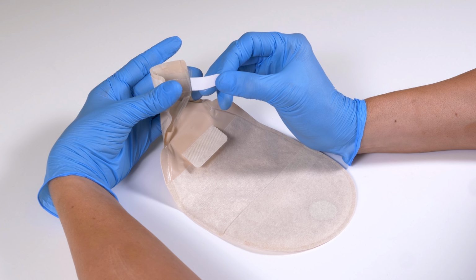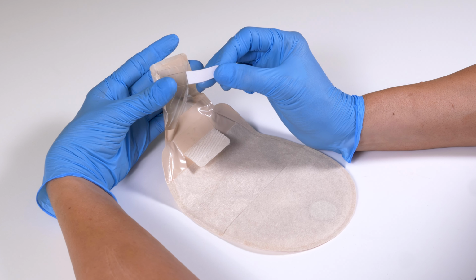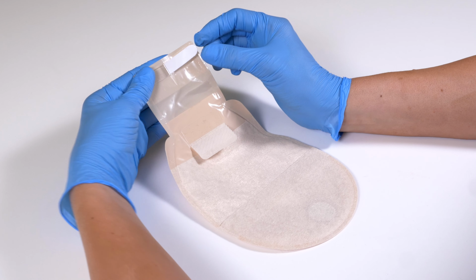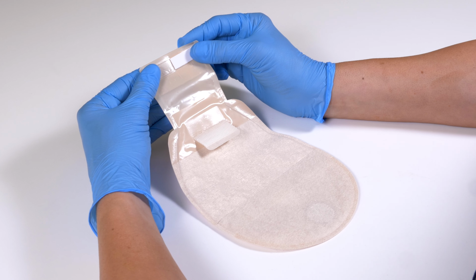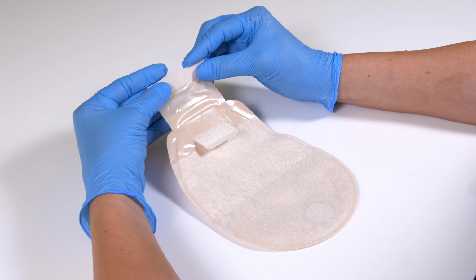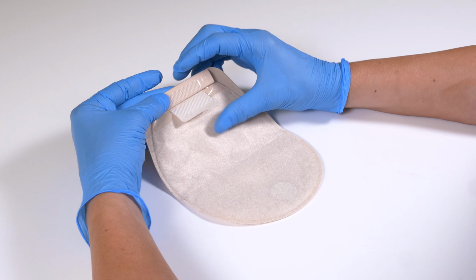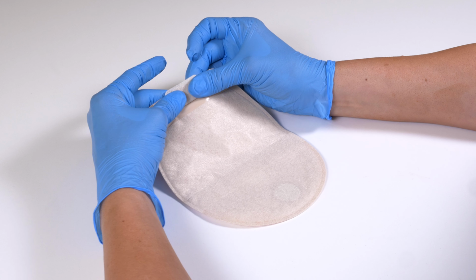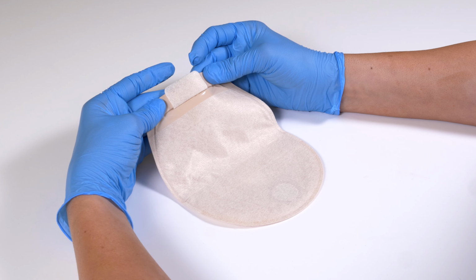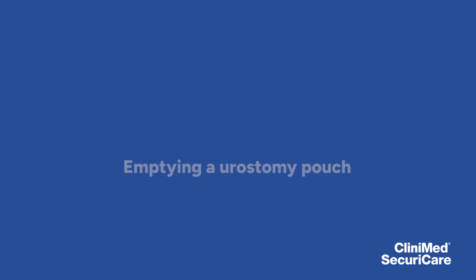Once the pouch is empty, clean the outlet. Use toilet paper to wipe the outside edges in a sliding motion and then clean around the inside of the opening. To reclose the pouch, fold the outlet upwards and reconnect the hook-to-hook fastener. Start pressing in the middle and work your way outwards. You'll feel the fasteners click together, creating a secure seal.